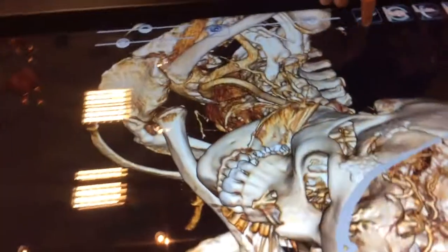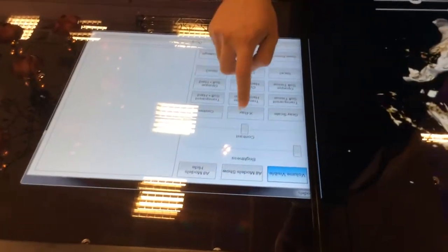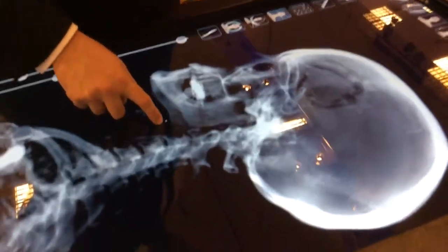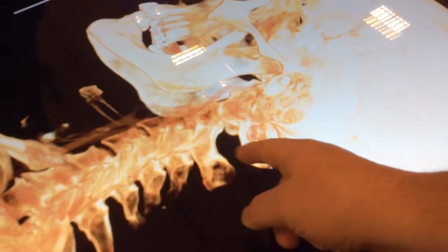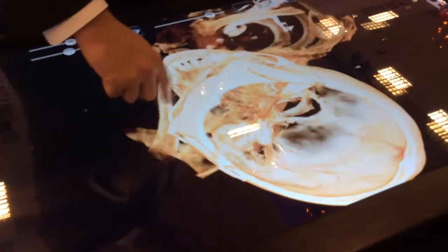Right, absolutely. Incredible. And so here we can also play with visualization settings. Let's say if we wanted to simulate an X-ray, we can simulate an X-ray as well. Yeah, that's nice. You see the spinous process. So that would be C1 up there. That's C1, C2, C3, C4. I'm using my finger here. But C1, C2, C3, C4, C5, C6, C7. Nice. And so here, this highlights the densest portions of the scan. You can actually see the clips very clearly here.